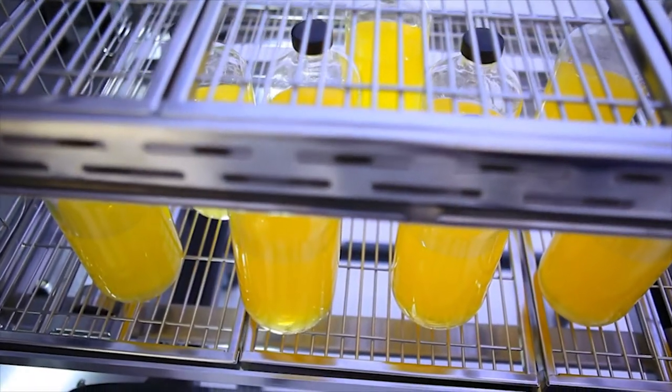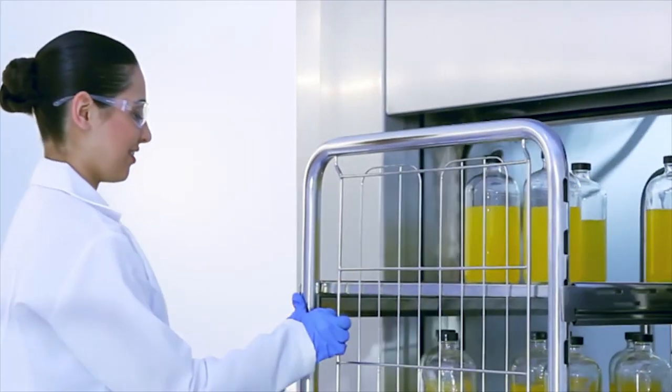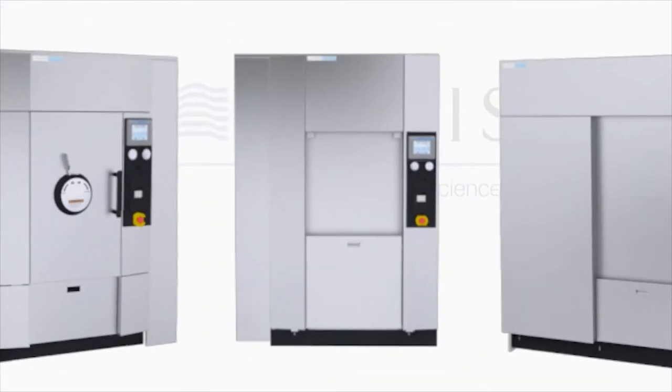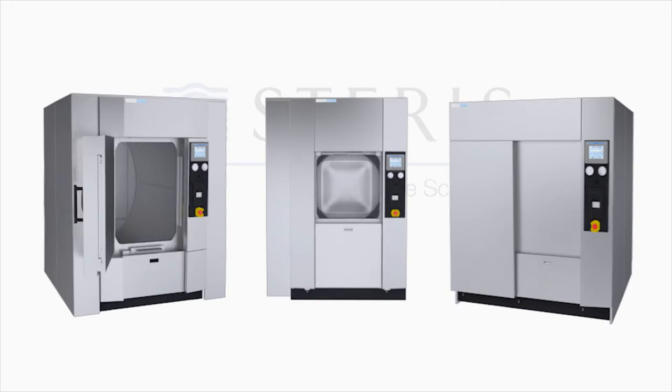From a media preparation laboratory to a BSL-4 environment, the AMSCO Medium LS series is versatile to meet the application demands. The medium LS sterilizers are available in various sizes and door configurations to accommodate a wide range of laboratory throughput requirements.